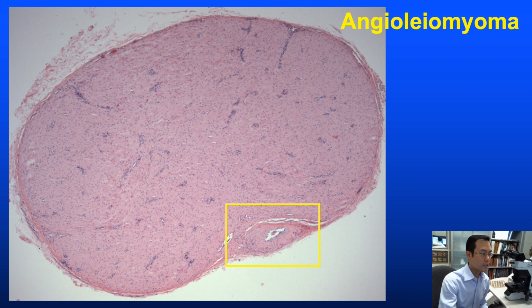Angioleiomyoma is a much deeper, circumscribed, often shelled out tumor nodule, and sometimes it'll appear that a precursor muscular walled vessel is present.